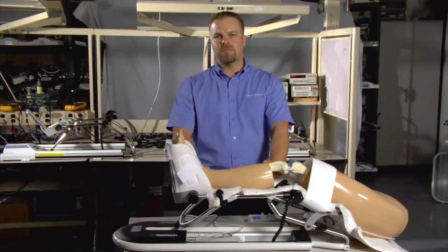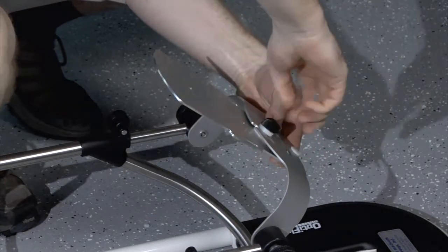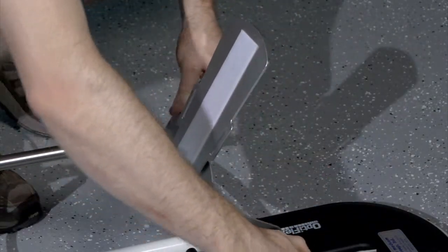Most modern CPM machines have a pediatric foot plate for very short patients. By following the simple steps outlined in the video, you can convert your CPM for pediatric use. To further increase patient comfort and compliance, you can also adjust the foot plate for rotation and plantar flexion.